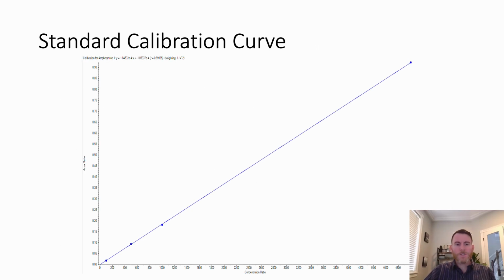All right. So let's talk about what that looks like in a standard calibration curve. This is a very tiny picture, and I apologize, but let me call out that on the x-axis here is that 1000 nanogram per mil calibrator, and you can see that you got an area ratio of 0.2.